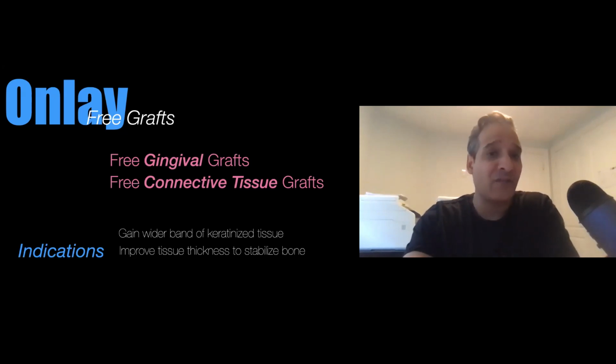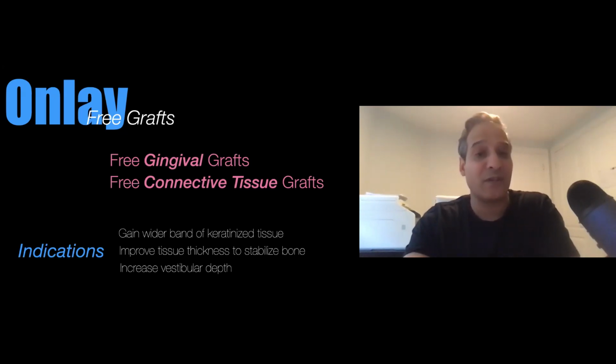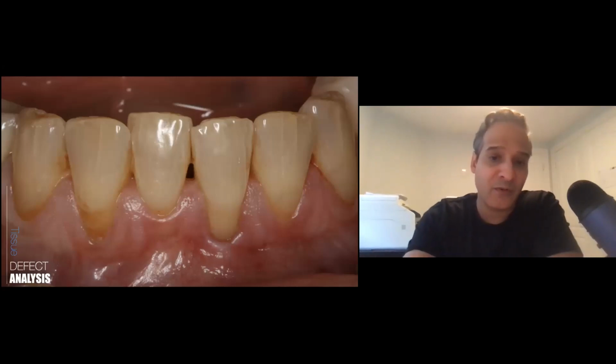So indications for these free onlay grafts are, number one, to gain a band of wider keratinized tissue to improve tissue thickness and stabilize the bone levels, as well as a good way to increase vestibular depth when you need it. So here we go. Here's our first case.